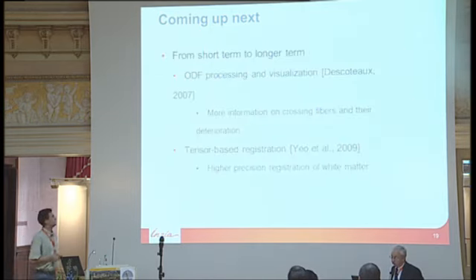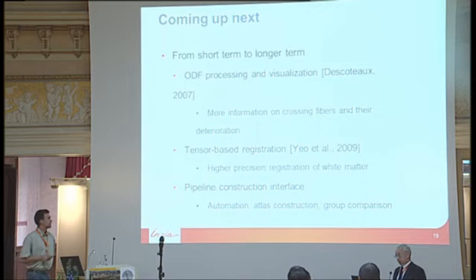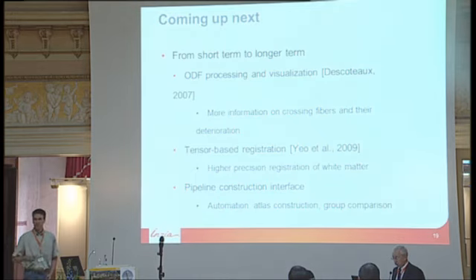The second point is tensor-based registration, which is once again bringing higher precision in terms of aligning the patients, and especially for the white matter. So we are going to bring that very soon as well. And finally, the last part we want to do very much is the pipeline construction interface, because in your studies, as has been said before, you want very often to do atlas construction, group comparison, one patient versus multiple controls comparison, and this requires automation.